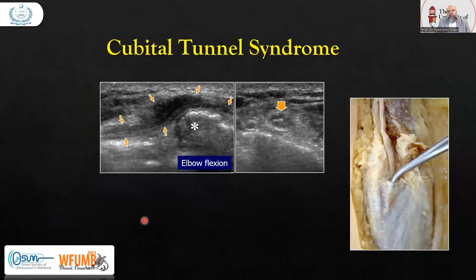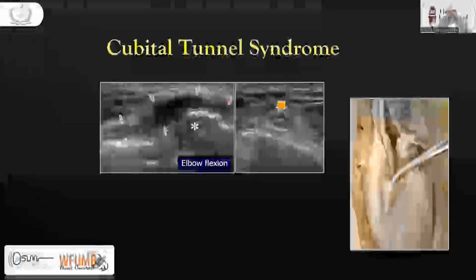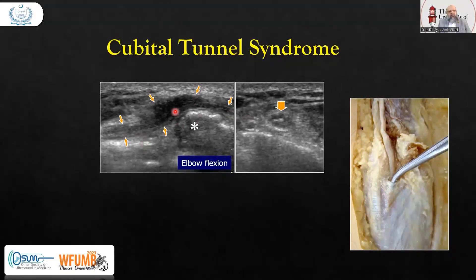This is a case of cubital tunnel syndrome, which happens with the ulnar nerve as it passes through the cubital tunnel — a tunnel formed by muscle, ligament, and bone. Whenever there is injury to the elbow, the ulnar nerve becomes inflamed and irritated, causing pain and numbness. Here is the nerve in the cubital tunnel. The retinaculum or ligament will be thickened. You can see the swollen ulnar nerve in flexion versus extension.